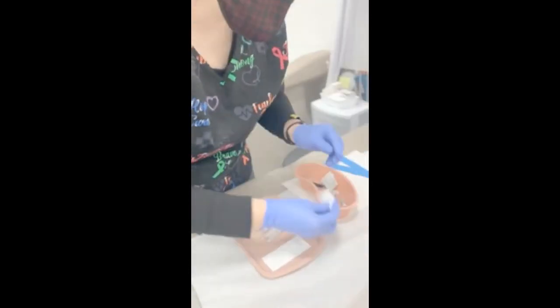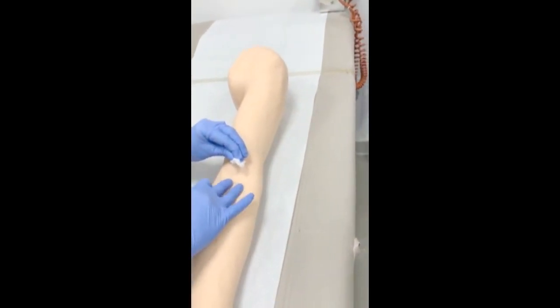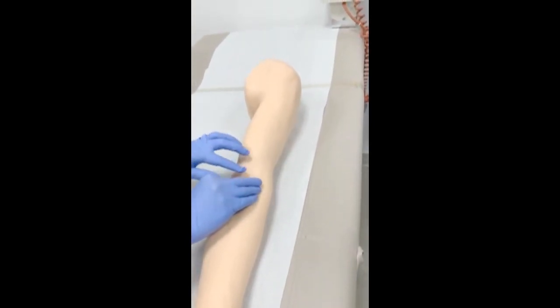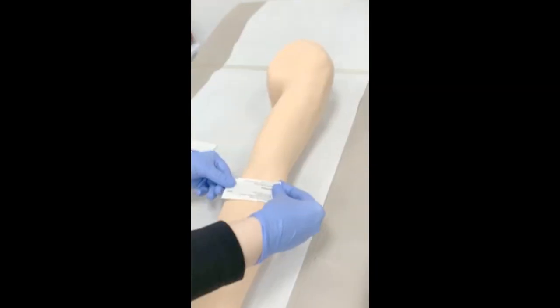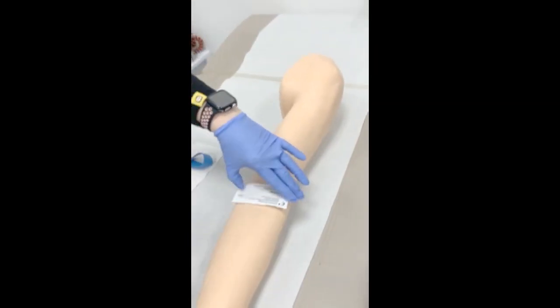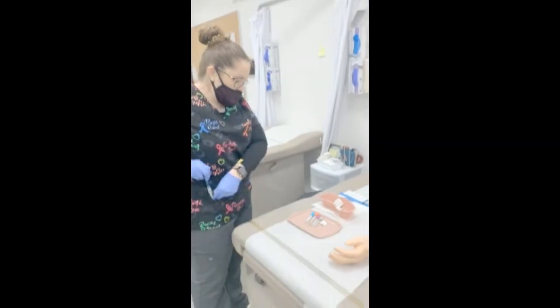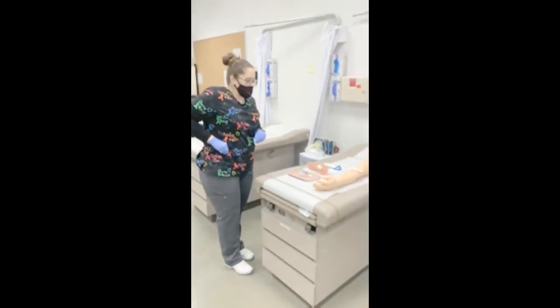I'm going to go ahead and double check, make sure you're not bleeding anymore. Wonderful — it looks like it's stopped. I'll put on a new gauze, get your bandage on, and you are all set to go. Mr. Barnes, you have a wonderful day. Take care. Bye bye.